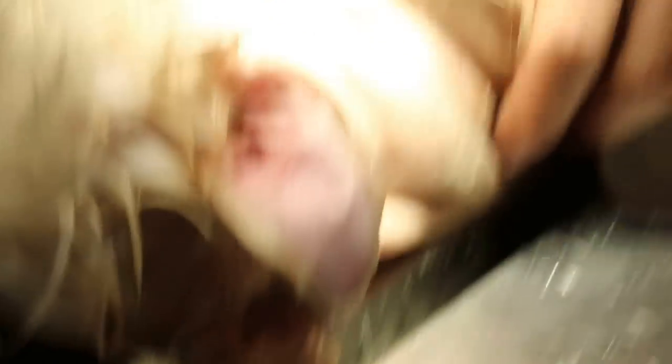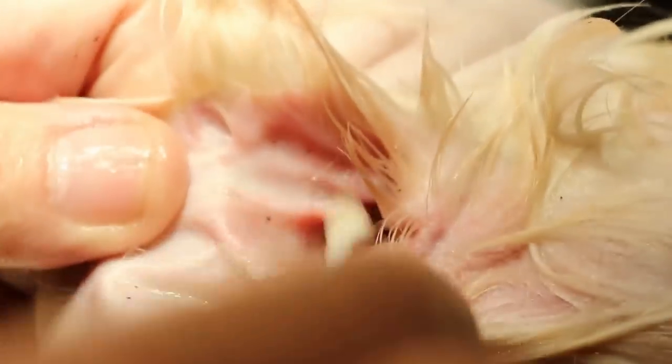Okay, now the other side. We check — we're going to check the other side. It's going to wake up already. So just a final check. One ear is worse than the other. Not so bad compared to earlier when it was all black. Normally one session can really help. After this, the owner will maintain it. Okay, finish.